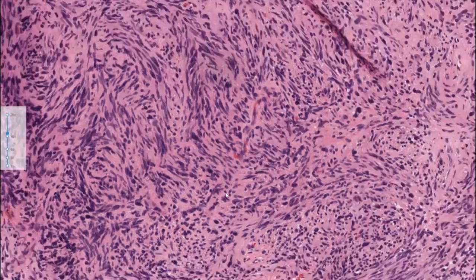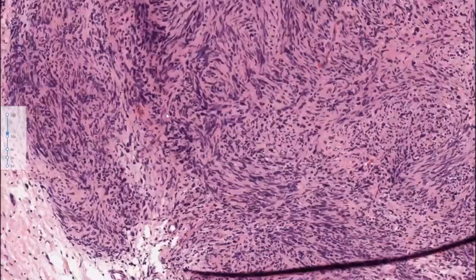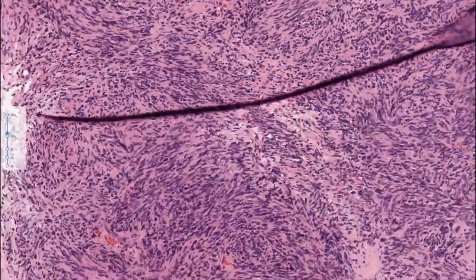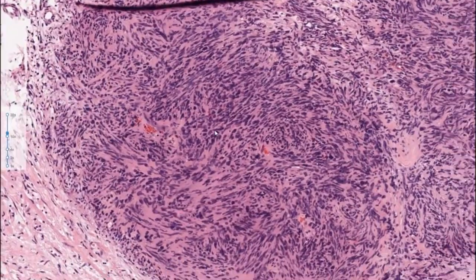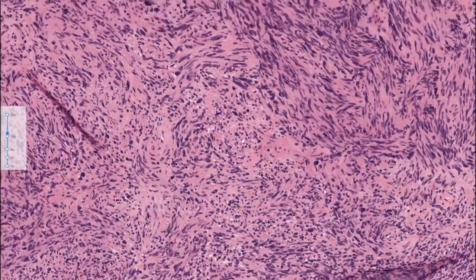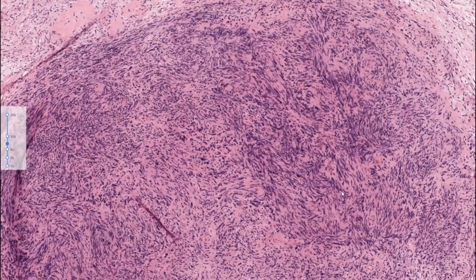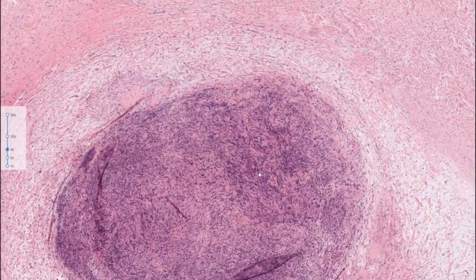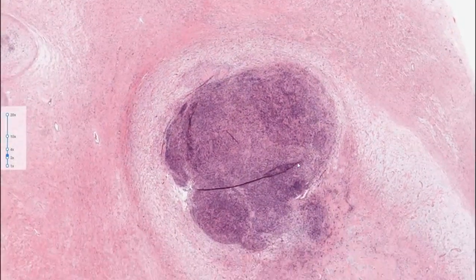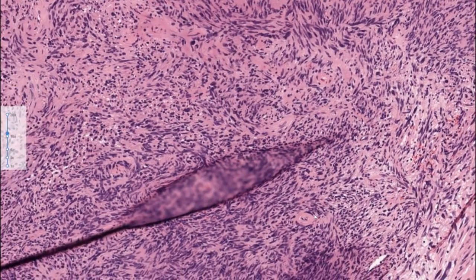But if you look at these and think about it, it's very circumscribed. I think there may even have been some mitoses, but the cells are a little larger, bundled. These had uniform S100 expression. And actually, it looks almost more like a baby schwannoma, really. So very well circumscribed in an otherwise typical neurofibroma. And actually, this is a Schwannian cell nodule.